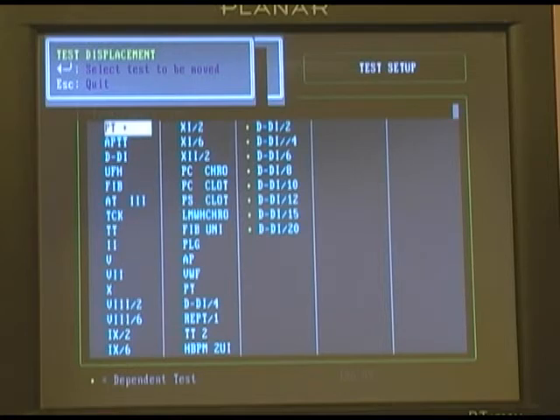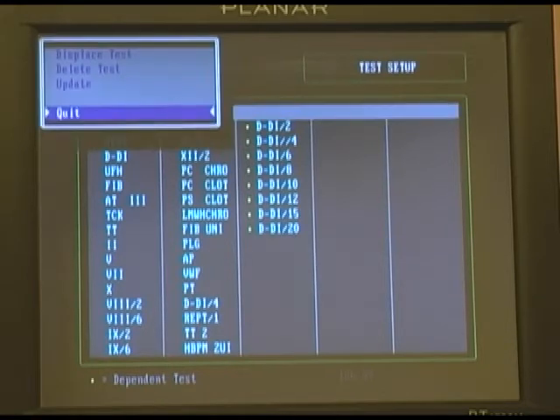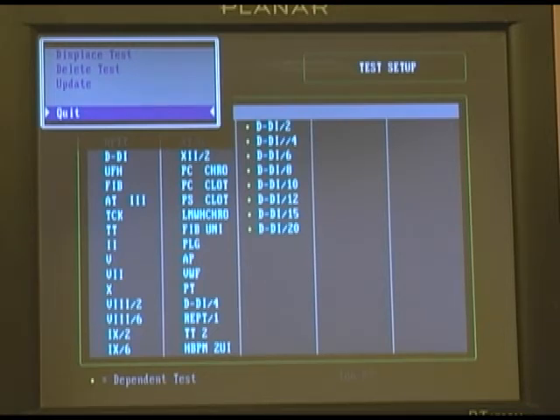We can move the tests up or move them down the list so that they appear where it makes the most sense for your work application. You can also delete a test and update a test by simply selecting that feature and pressing Enter.